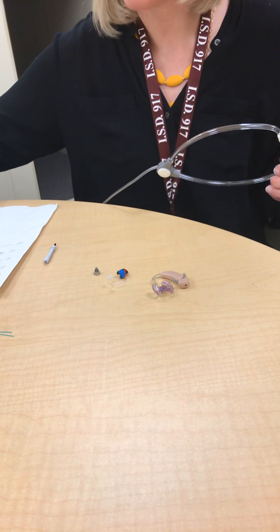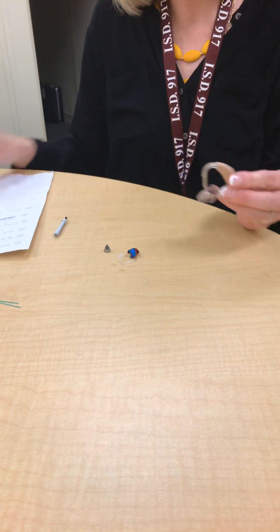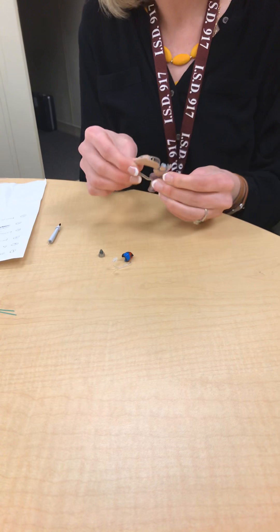Let's take a quick look at how to troubleshoot a hearing aid. You've been provided with a bag of supplies, and in that bag are various things that are going to let you troubleshoot your hearing aid.